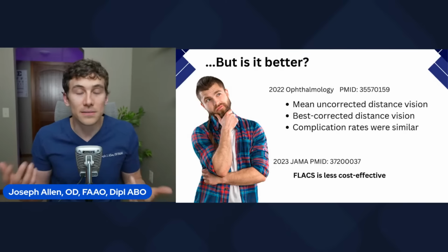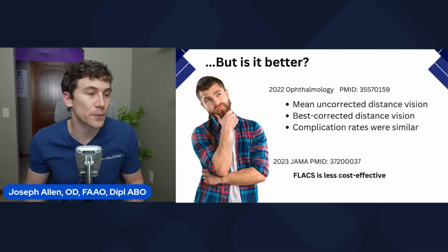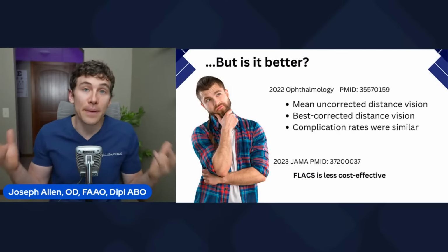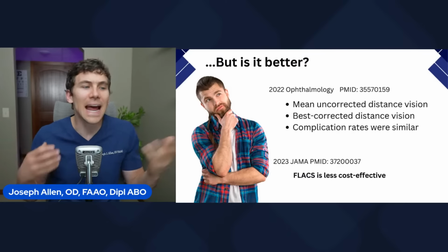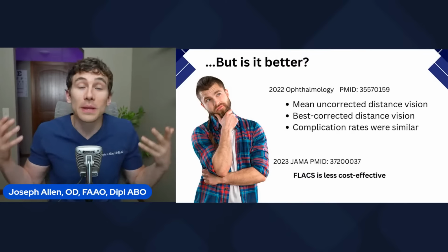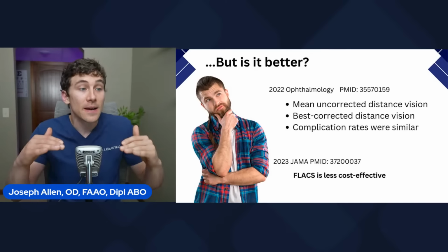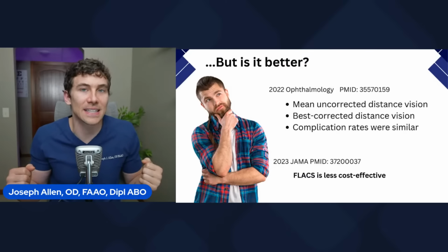So this has been investigated since about 2011, since laser cataract surgery started to come out. And in 2022, a publication did find, comparing many different procedures, that the mean outcome of improved vision in the distance without glasses, as well as the ultimate best vision from patients even needing glasses afterward, found that both of those techniques were basically the same.